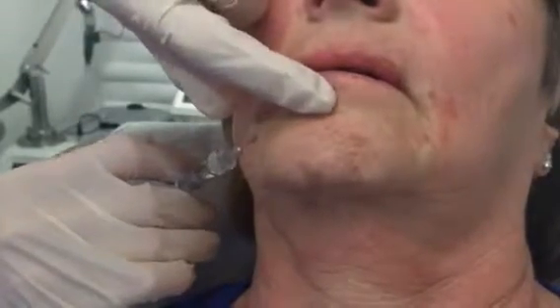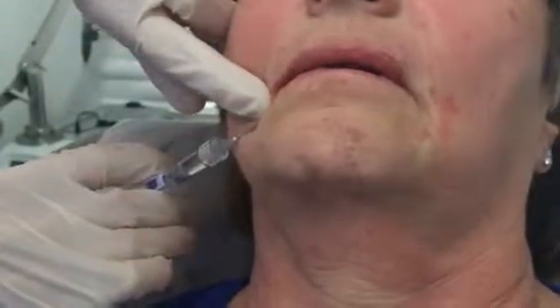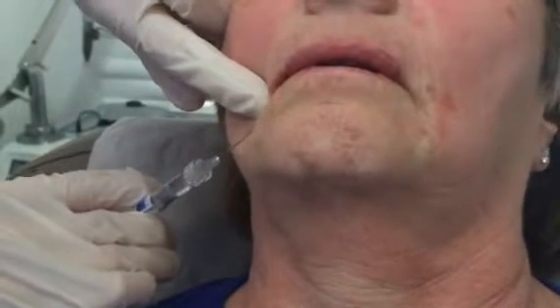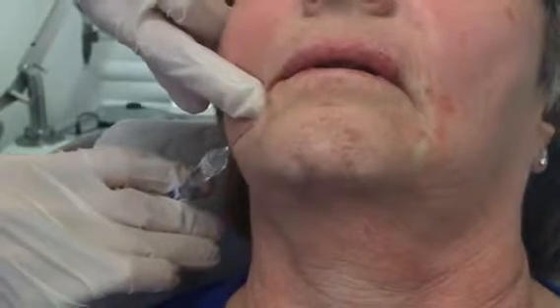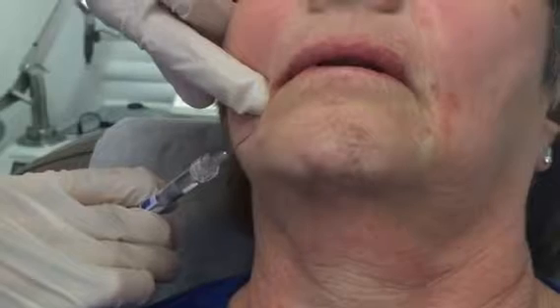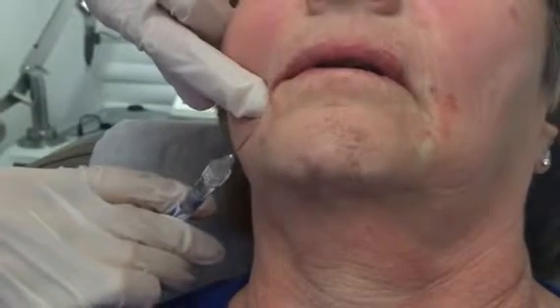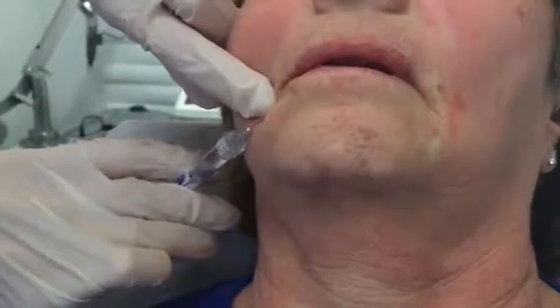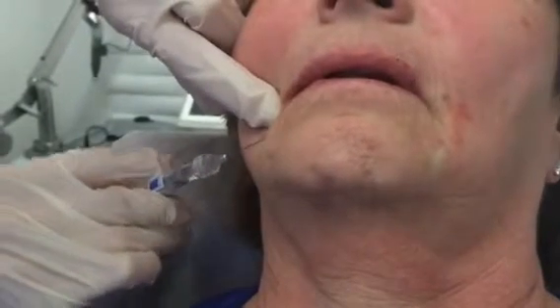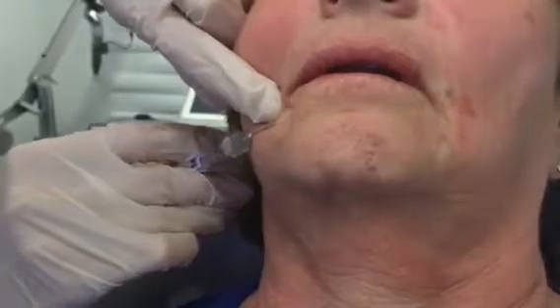My tip is just right there and we're just depositing a very small amount of the filler itself. I'm just right in the border where the cannula actually moves along really nicely, and we're just providing again a little bit of foundational support to that area.